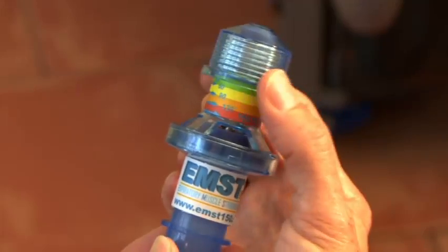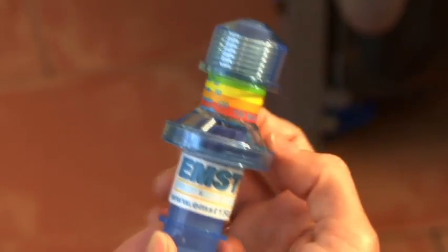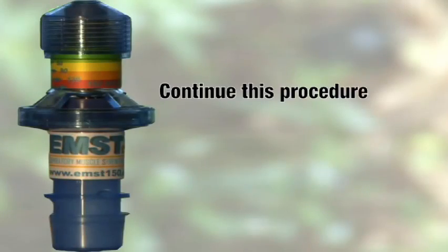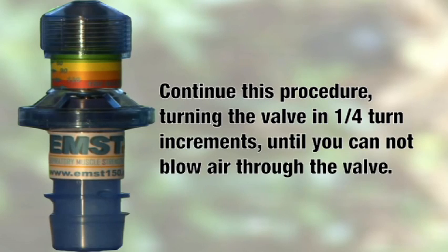Then stop. If you were able to accomplish the previous steps easily, turn the knob clockwise one quarter turn and repeat the same steps. Continue to do this, turning the knob clockwise, until you are unable to move air through the device easily. This stopping point will be the maximum pressure you are able to create and will serve as the starting point for your first week of training.